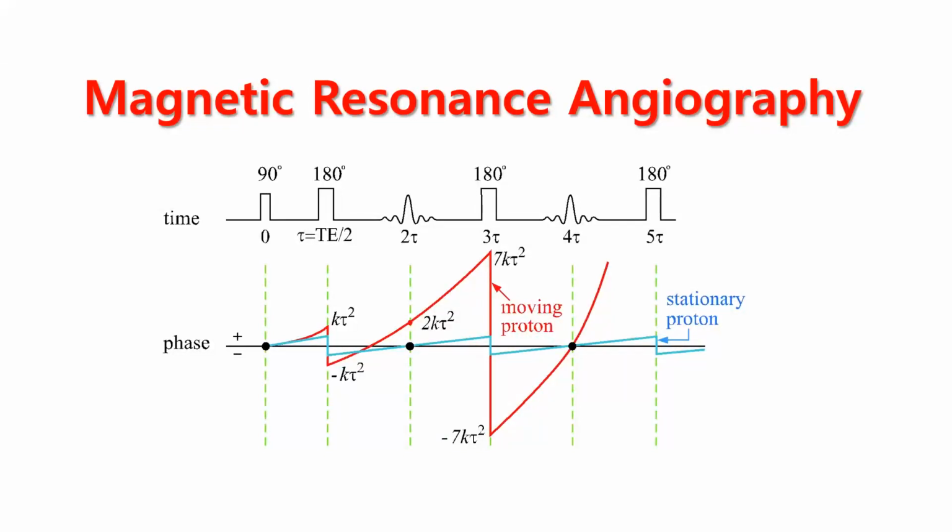In magnetic resonance angiography, MRA, the image of the blood vessels is obtained using MRI techniques. In today's lecture, we will see the basic principles of this MRA. We'll also see the principles of functional MRI, fMRI. This fMRI is used for brain mapping research.